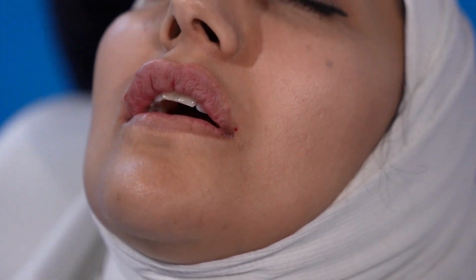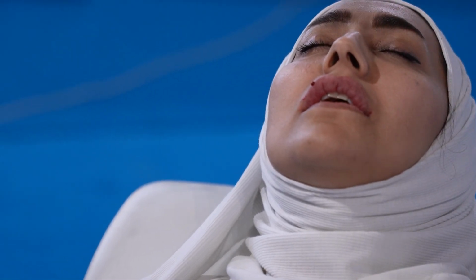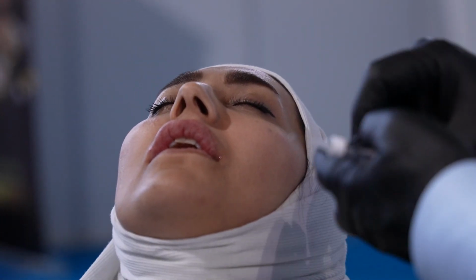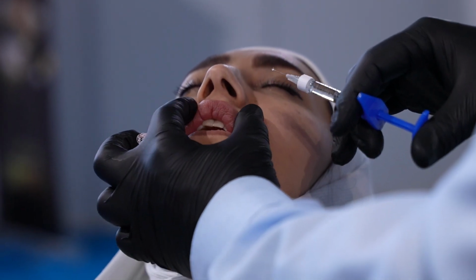Now from the middle please, from the middle. At least if you can assess, however, the illumination is not very good, but the symmetry kept, we need to inject for the volume also.